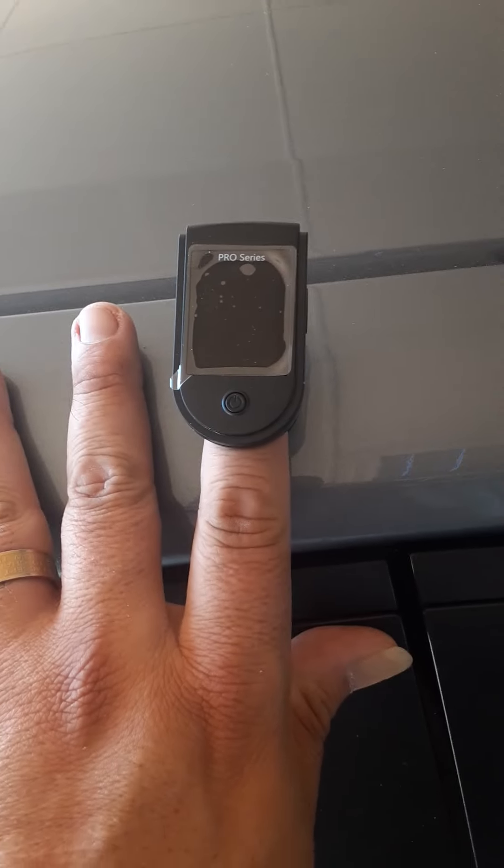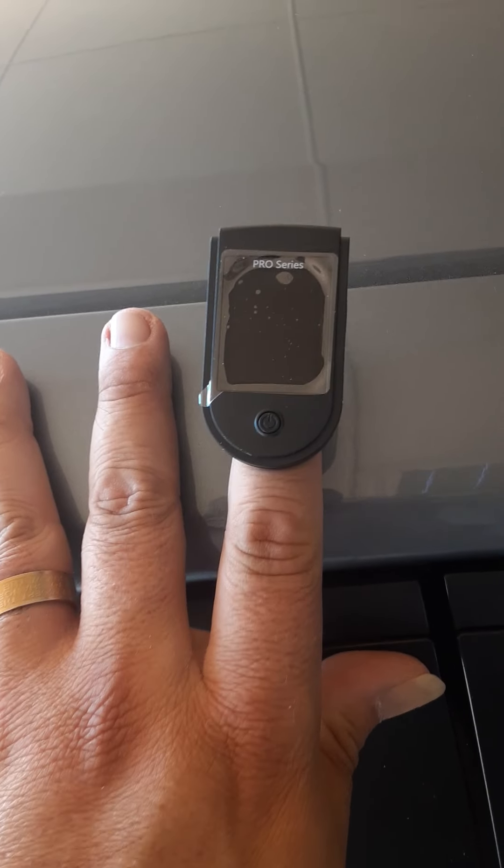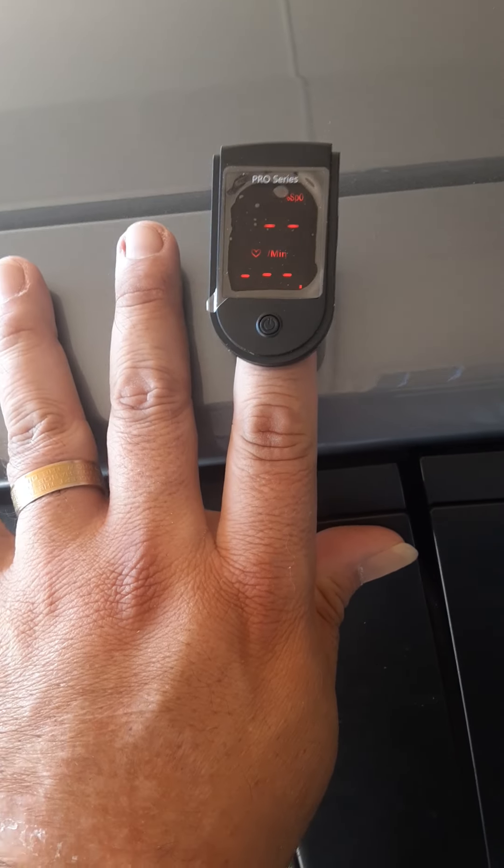Hello everybody! I just got my pulse oximeter from Amazon. I put it on my finger and I'm reading 94 — that's pretty good. I'm sitting down outside, not doing any activity. That's pretty much what it should be; 95-97, mid to high 90s, is normal.